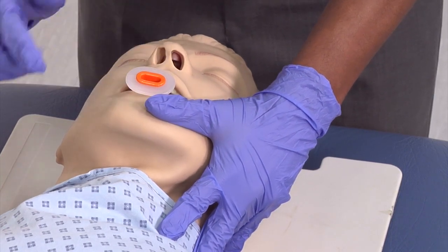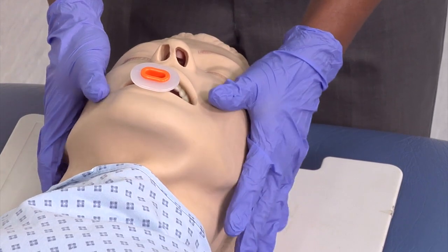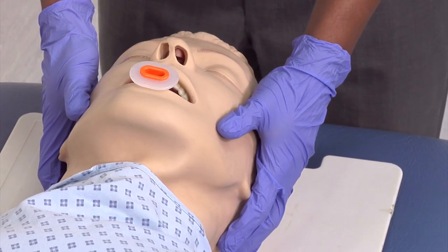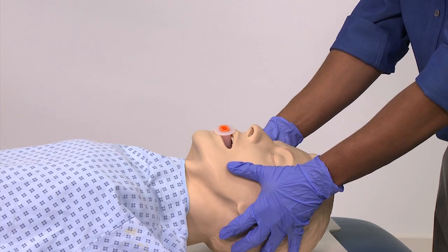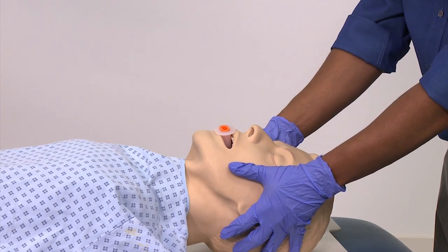Inserting the Guedel upside down like this may feel counterintuitive, but is done this way as the inverted curved body presses the tongue down to stop it falling back and obstructing the airway.